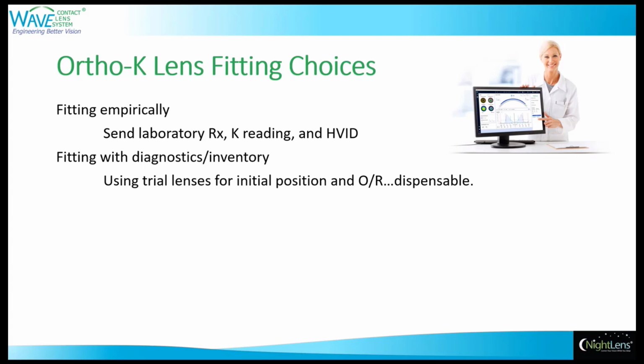In order to make it work for you, for not only one patient, but continuing patients, you must replace the lenses that you dispense. If you don't, you actually are degrading the inventory system. The other issue is, how do I maintain the lenses that aren't being used?